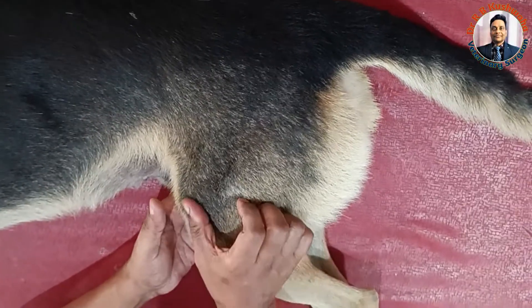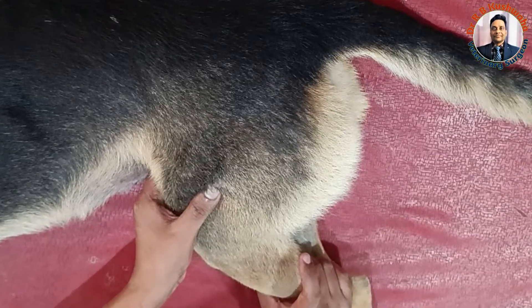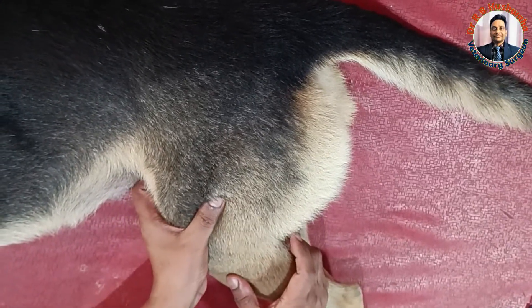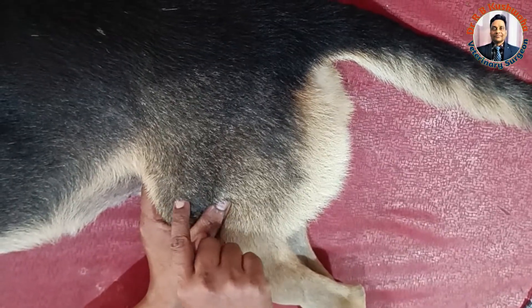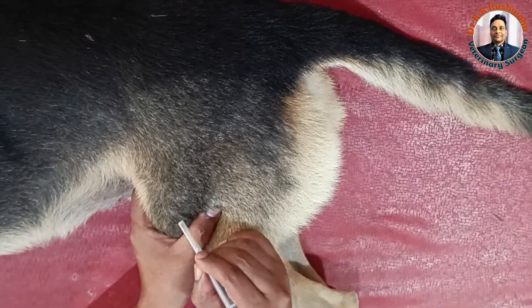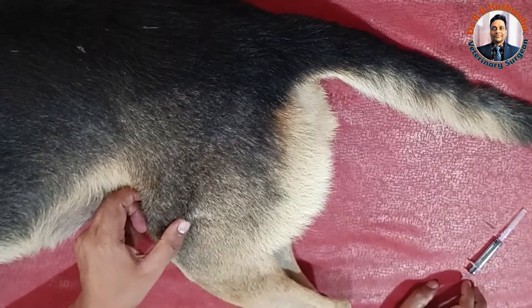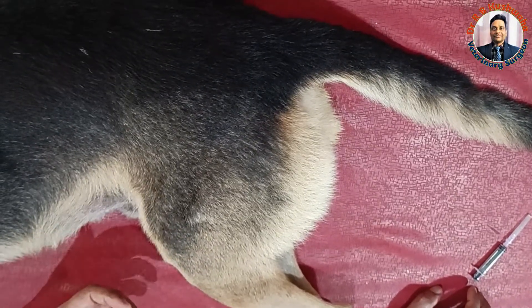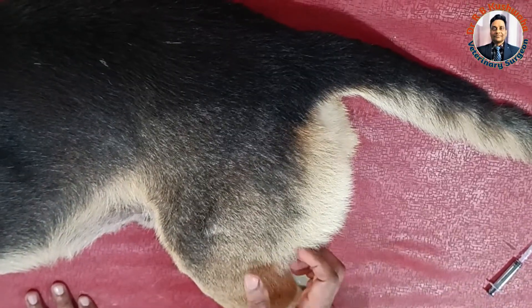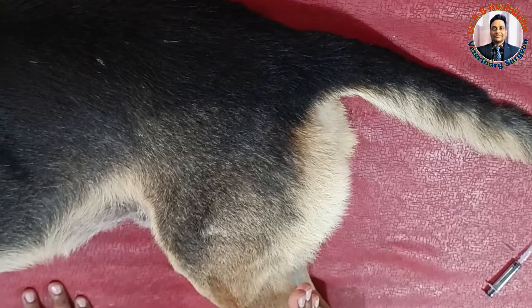In the hindlimb, you can also give the injection in the vastus lateralis muscle, which is just cranial to the shaft of the femur. Place the thumb here and inject like this — you should not direct the needle too deeply in this area. If the volume of injection is very small, like 1 ml, it is better to give it here. Otherwise, normally we give in the caudal thigh area, which is the most common site for intramuscular injection in the dog.